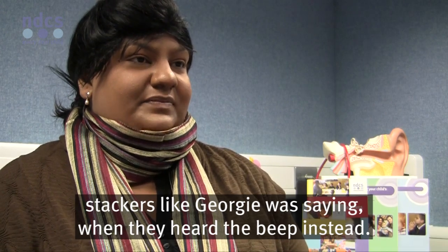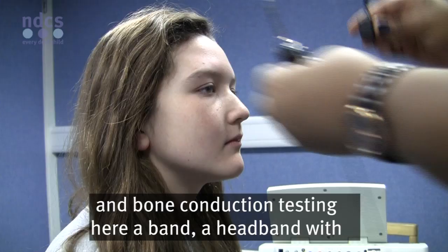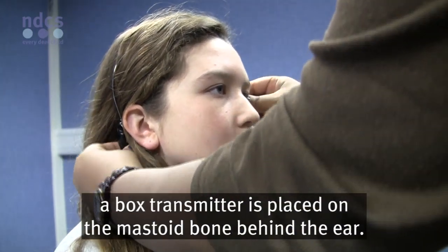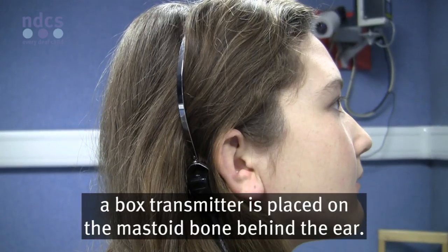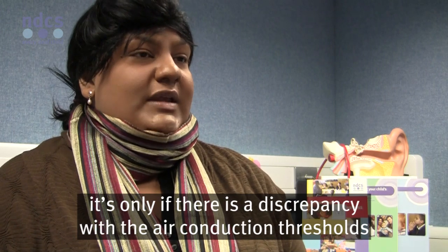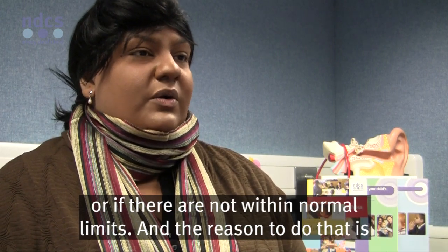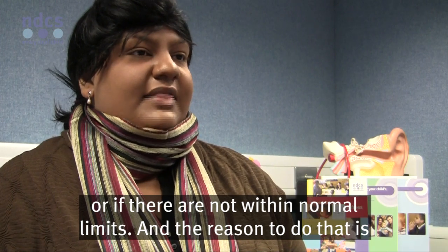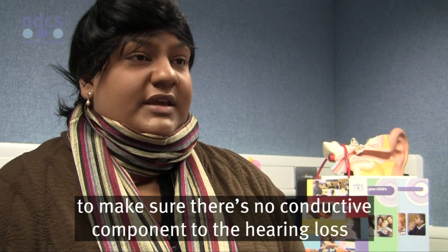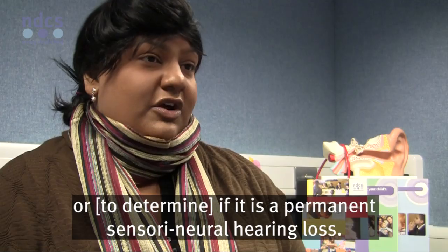With pure tone audiometry, there are two parts: air conduction testing with the headphones, and bone conduction testing, where a headband with a box transmitter is placed on the mastoid bone behind the ear. Bone conduction testing is not done on everyone — only if there's a discrepancy with air conduction thresholds, or if they're not within normal limits. The reason is to determine if there's a conductive component to the hearing loss, or if it is a permanent sensorineural hearing loss.